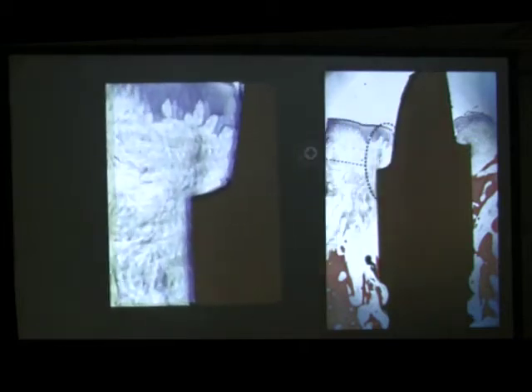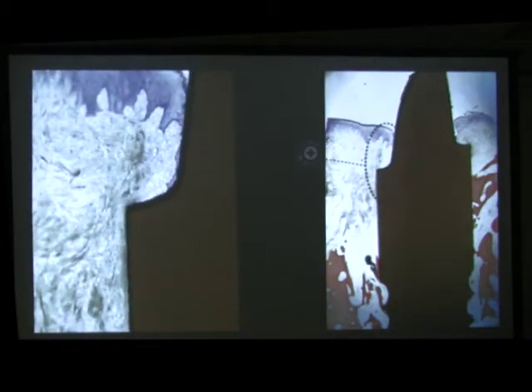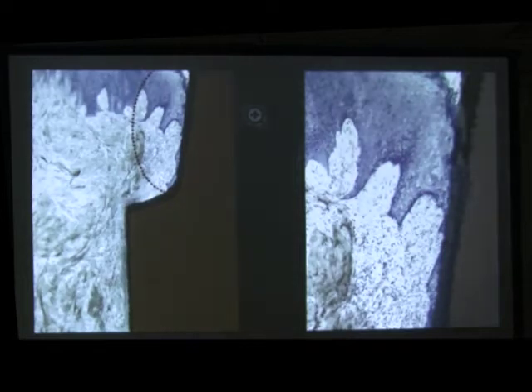When we zoom the other part of the implant, this is what we see. It's a very healthy gum. When we zoom even more, this is supposed to be the free gingival area. So when we look at titanium, yes?